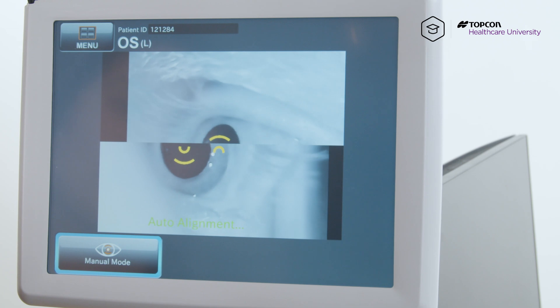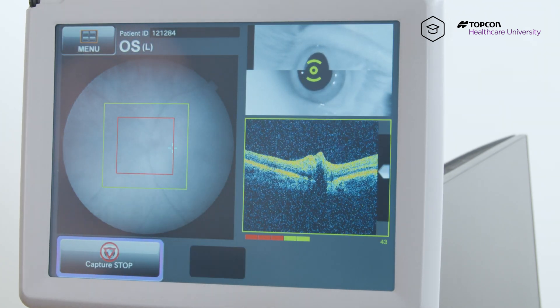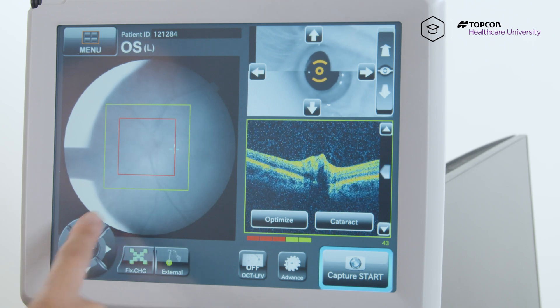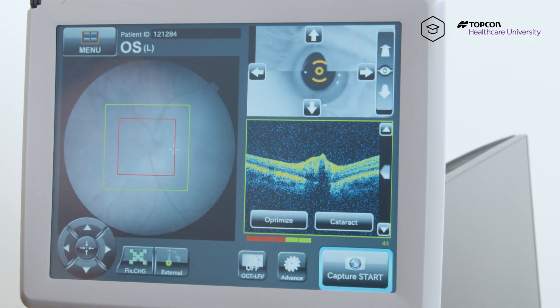Let the patient know to blink normally and to look for the green X towards their nose. Hit capture stop to get into manual mode. And if you have a little bit of glare, you can always chase the glare by holding down the arrow in the direction to get rid of it.